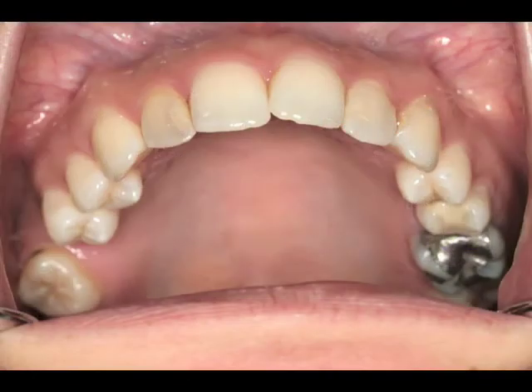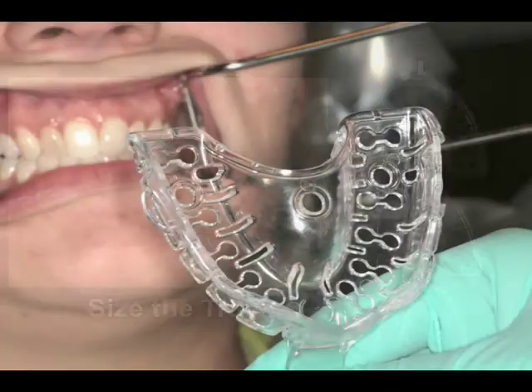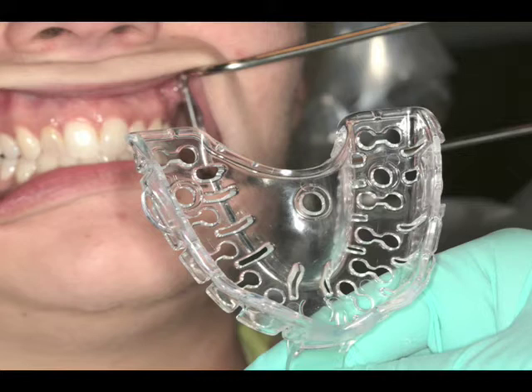As seen here, we have a dentate maxillary arch. The very first thing we do is to size the tray. We have three sizes: small, medium, and large. We take the tray and size it to the existing arch. If the tray doesn't fit exactly, we can actually heat shape the tray.